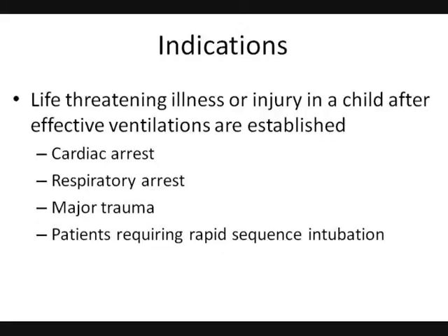And a child, as described for our protocols, will be any human that fits within the length of the Broselow tape. And those life-threatening incidents that we just described include cardiac or respiratory arrest, major trauma, and patients requiring rapid sequence intubation in the absence of vascular access through the normal venous approaches.